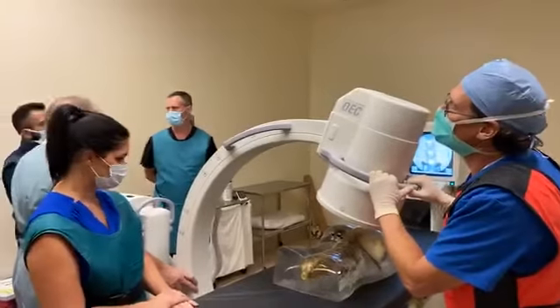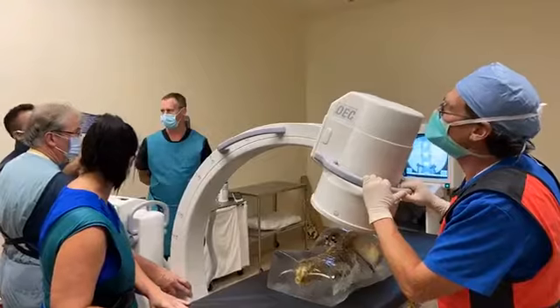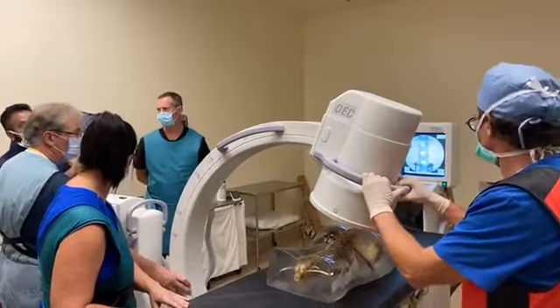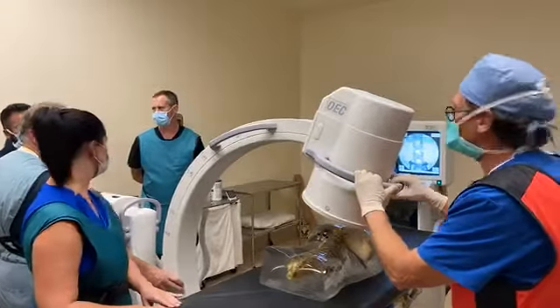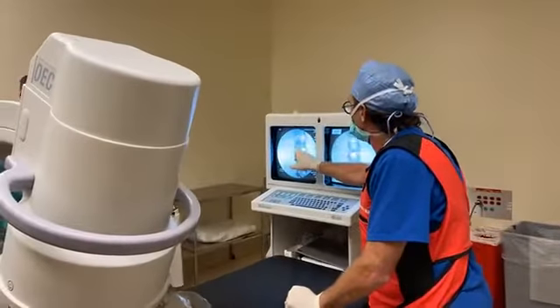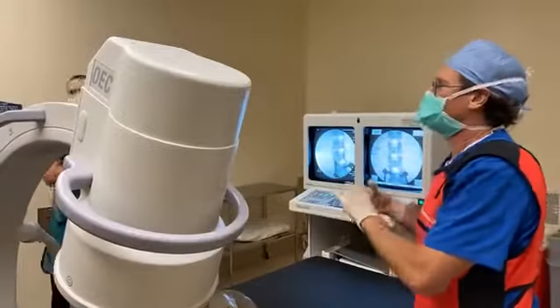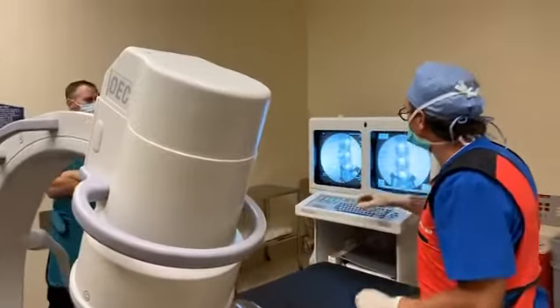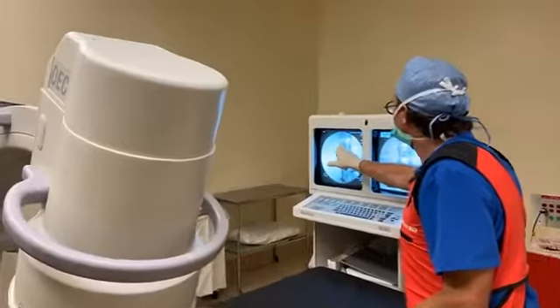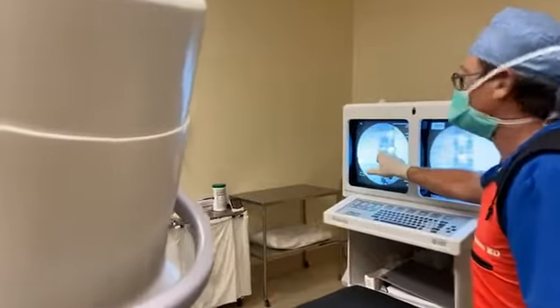So you were explaining that you have two facets there, or two nerves, I should say. So you would burn both those nerves. That's correct. So for this facet joint, if you wanted to take away the innervation, if you wanted to destroy the nerve, you would burn this nerve here, and you would burn this nerve here.